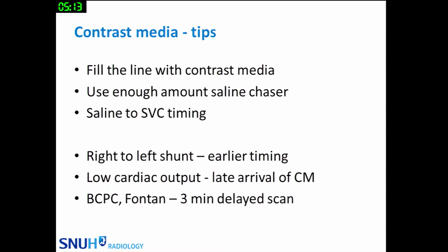When we take the CT, because the scan is taken in just 1 second, my recommended timing is when the saline arrives at the SVC. This saline is a saline chaser after the contrast media. When that saline chaser arrives in the SVC, that's the proper timing for the imaging. But we have to adjust the scan timing because I do not use bolus tracking. I usually set my scan delay from experience and calculate the arrival time.